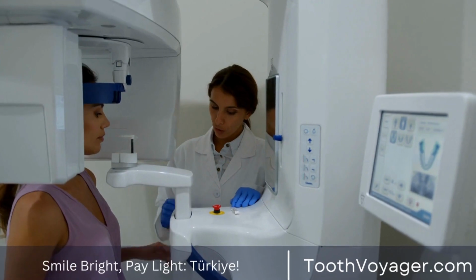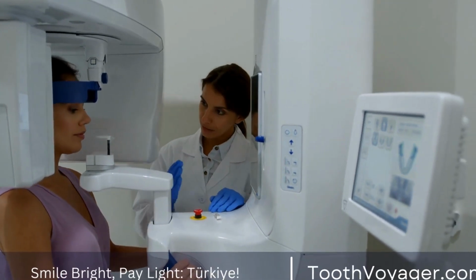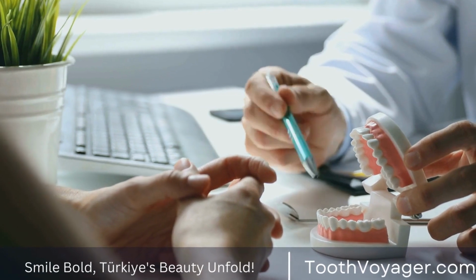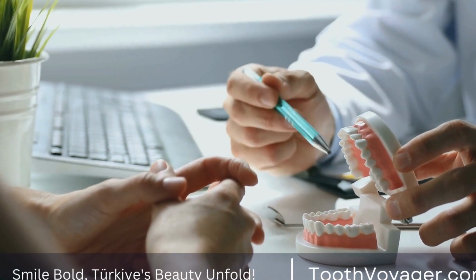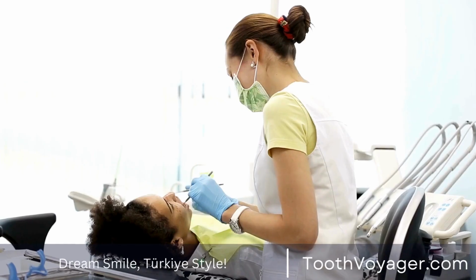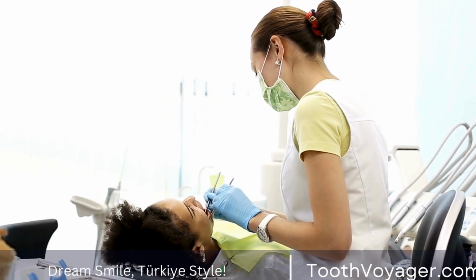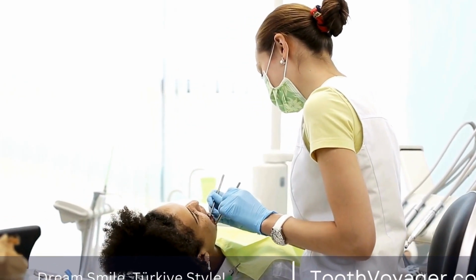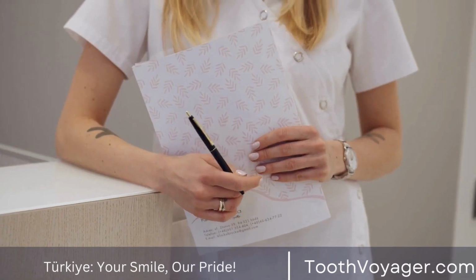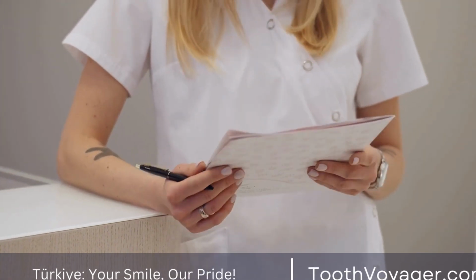The initial step of the procedure involves preparing the tooth for the crown. It involves taking out any affected or decayed areas of the tooth and then shaping the tooth to allow for the crown. After the tooth has been prepared and shaped, an impression of it is made using dental putty or scanning technology. The impression is then used to make a mold of the tooth.